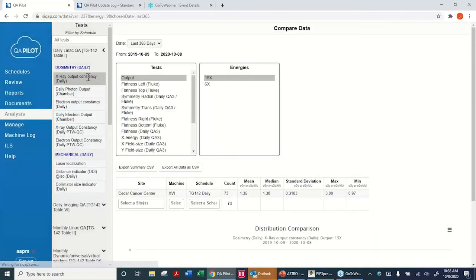These are things that help you feel like, okay, I've got 4 TrueBeams. These 3 seem to be, I seem to get the same type of results for my daily QA on 3 of them, but the 4th one seems a little bit off. Am I just suspect, or am I going crazy, or is there really something to what I feel is happening?